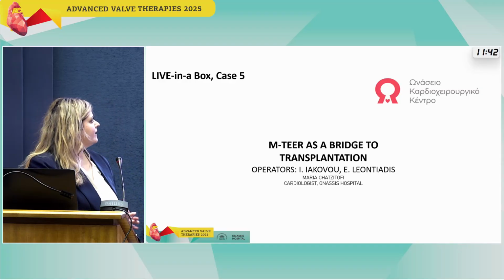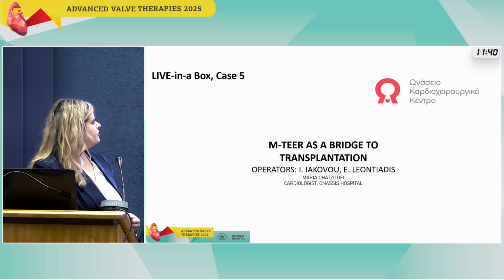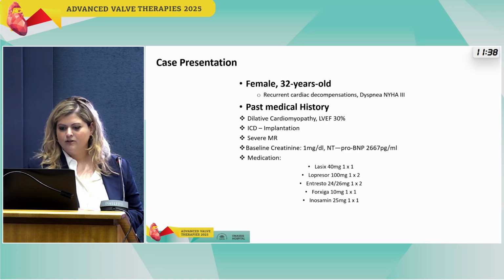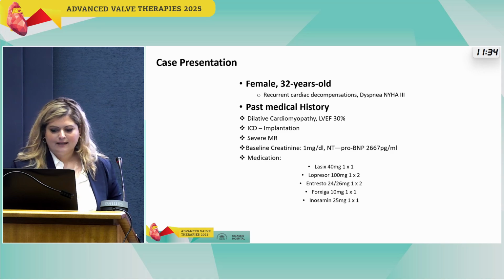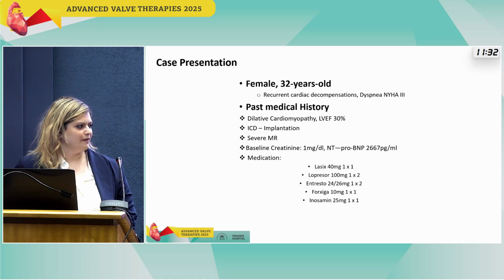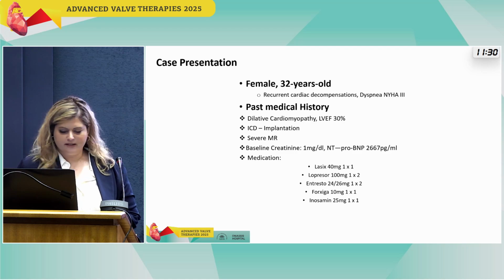Good morning. So I'm going to show a case from our hospital, from the Onassis Hospital. It's about a young female, 32 years old. She has a dilated cardiomyopathy with an LVEF of 30%. As you see, she has all the optimal heart failure medication.